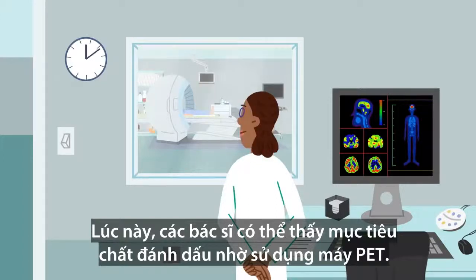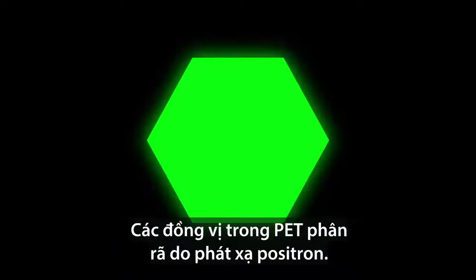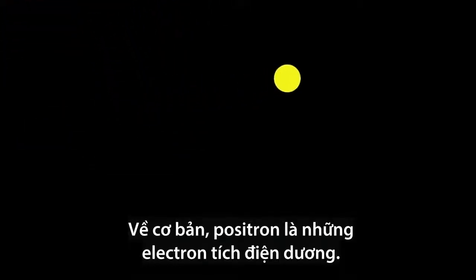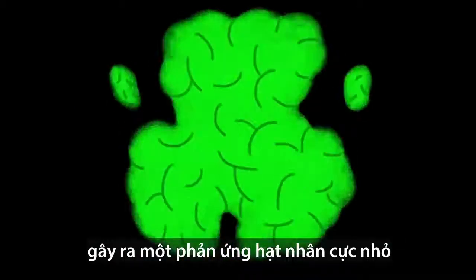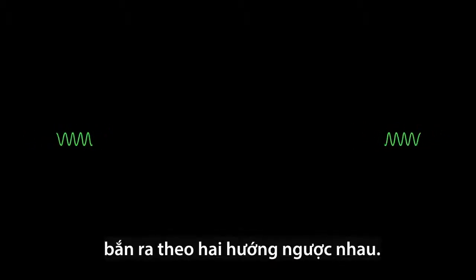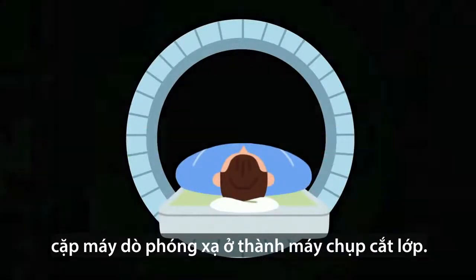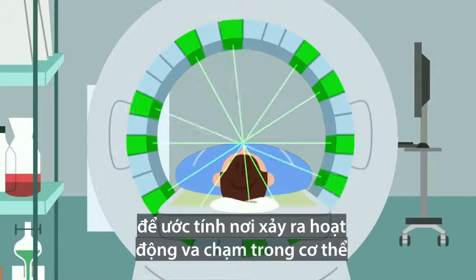Now the doctors can see their target using a PET, or positron emission tomography, scanner. The radiation that the tracer emits is what makes this possible. The isotopes used in PET decay by positron emission. Positrons are essentially electrons with positive charge. When emitted, a positron collides with an electron from another molecule in its surroundings, causing a tiny nuclear reaction in which the mass of the two particles is converted into two high-energy photons, similar to X-rays, that shoot out in opposite directions. These photons then impact an array of paired radiation detectors in the scanner walls.